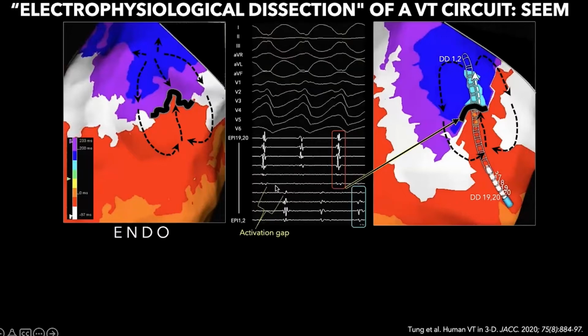This activation gap right here is the problem where we're missing the early part of diastole. This is the duodecapolar catheter that has equal contact force in one single position that is missing these components. There is nothing even far field spanning between these populations in red and then the population in blue that's emerging.